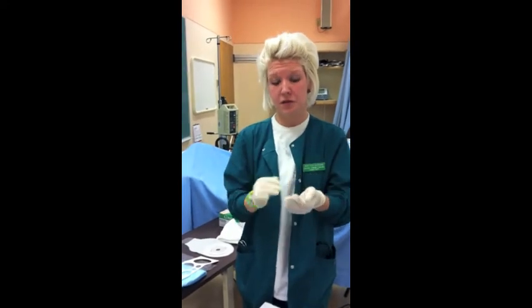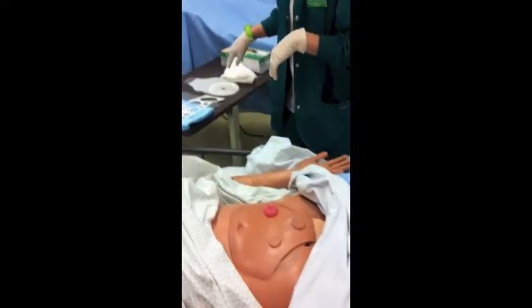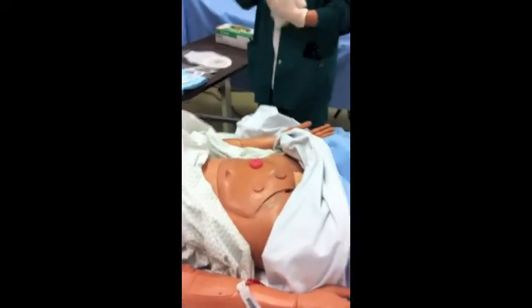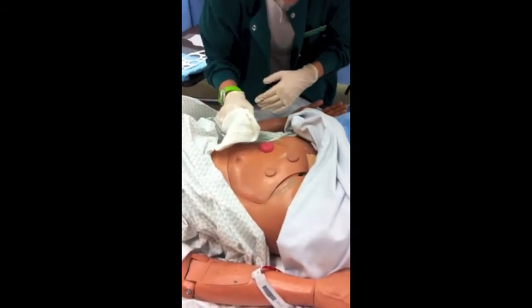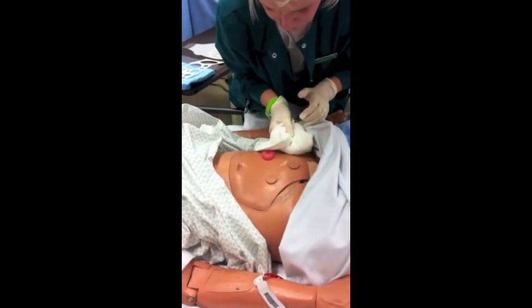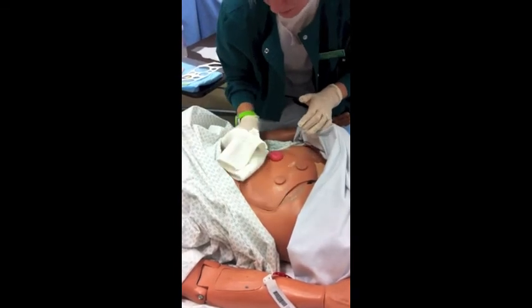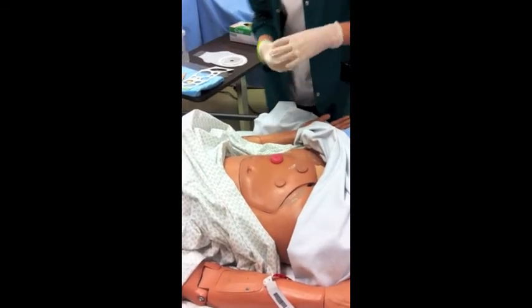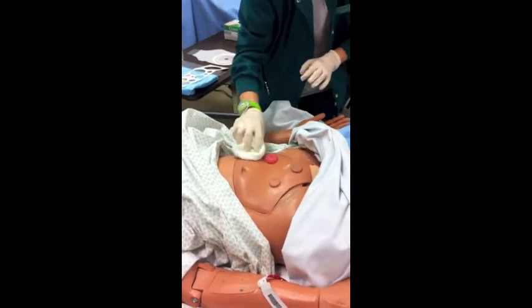So now I'm going to apply a new colostomy bag. I've discarded my old gloves and I've put on new gloves. I'm going to clean the skin surrounding the stoma with warm water, noting the skin, making sure that the skin isn't red or irritated, and I'm going to wash around the stoma, making sure my patient's comfortable as I do this. And I'm going to, with a new cloth, blot dry.